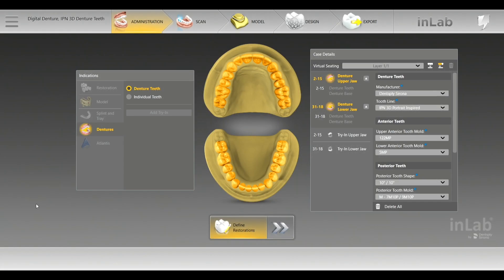Hi, this is Kevin Reck with Bellavita Dental Designs. We're based out of Arden, North Carolina. I'm a dental technician and I'm going to go over the new Software 20 Denture module with you.